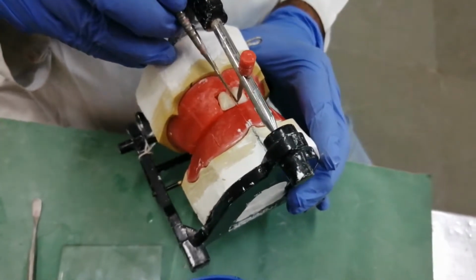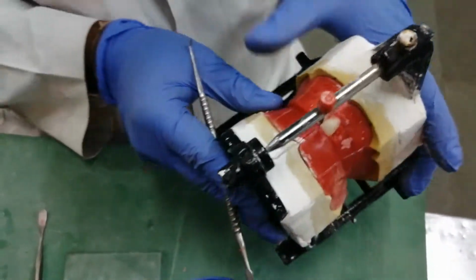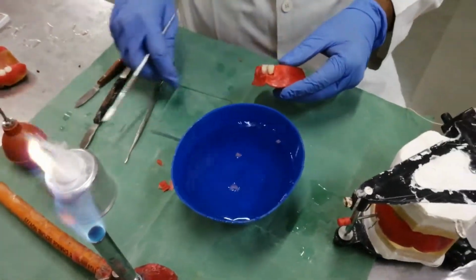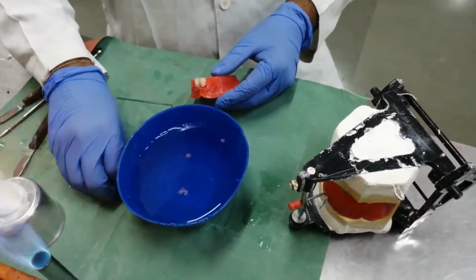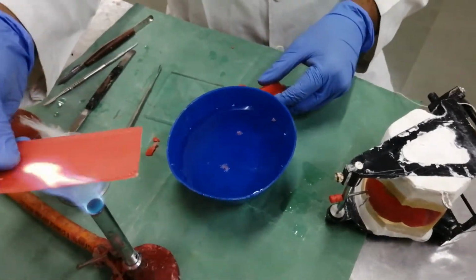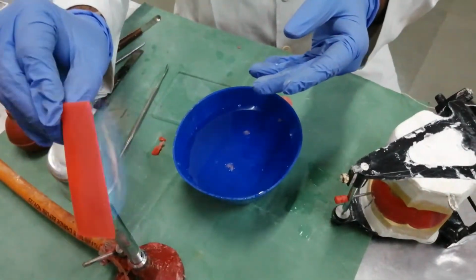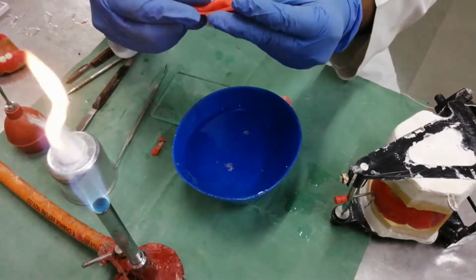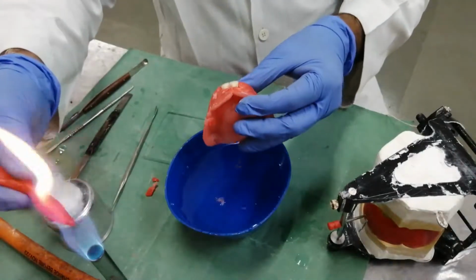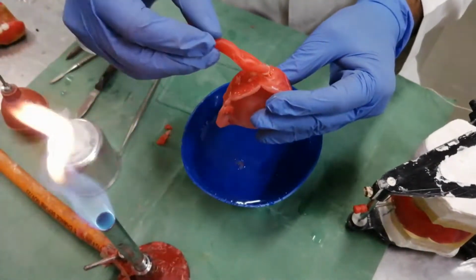After placement of both central incisors, you have to make sure that midline is not shifted. We are placing wax into the socket so that teeth do not move during teeth inclination setup.